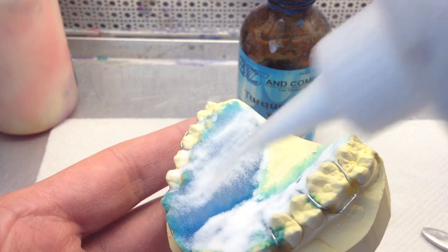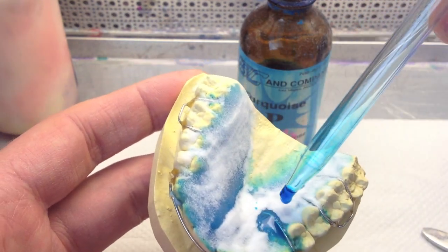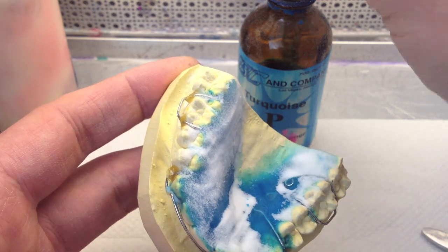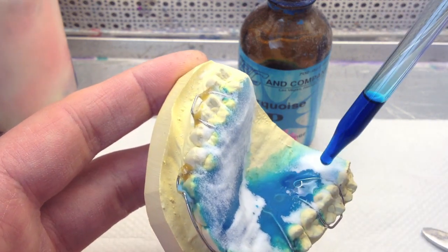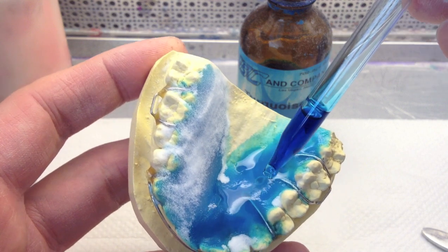Keep an eye out for the other side. Sometimes you'll have a lot more monomer in there than you think, and the powder that you sprinkle on there will get wet when you're not looking, and it'll start slumping on you.